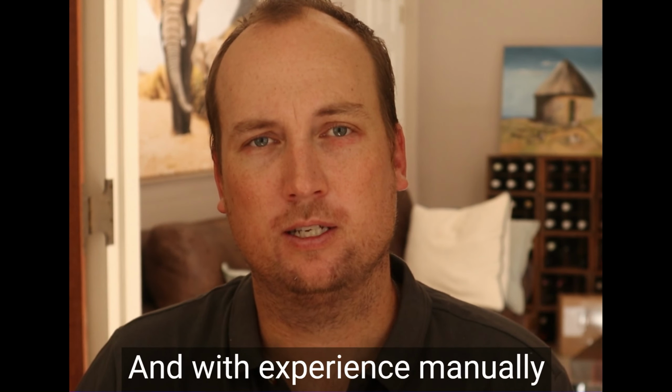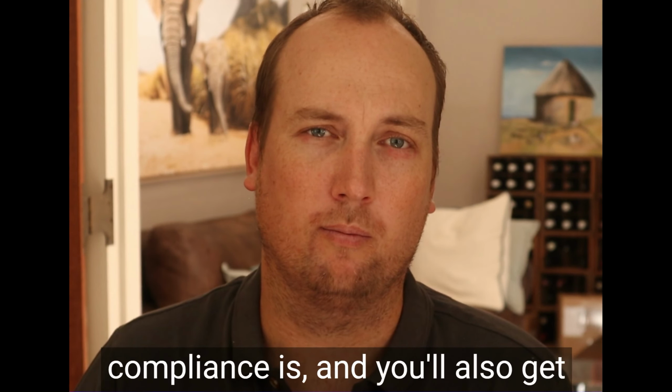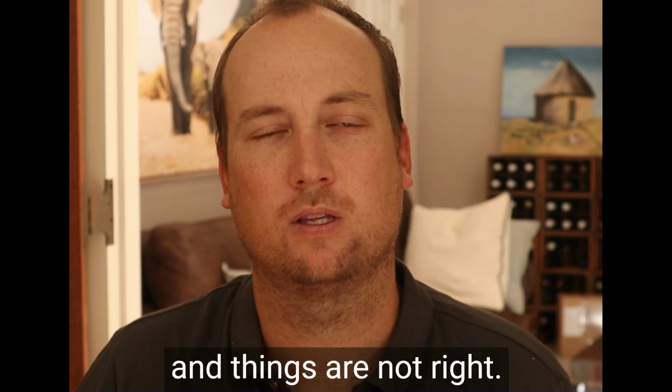And with experience manually ventilating enough patients, you'll get a feel for what normal compliance is, and you'll also get a feel for when the compliance or the pressure is really high and things are not right.